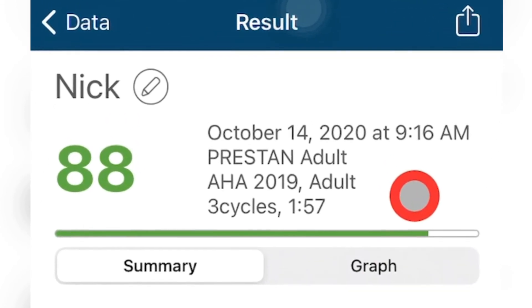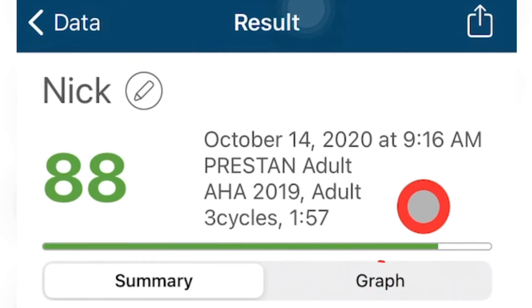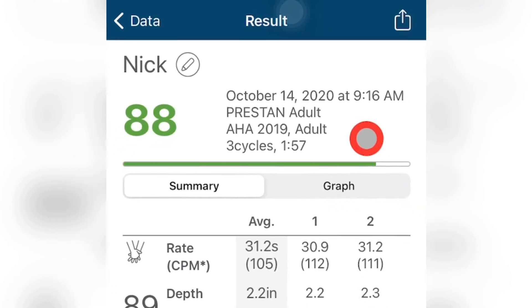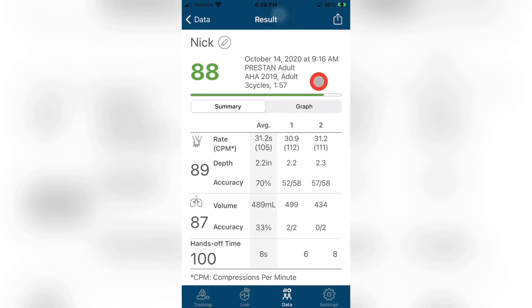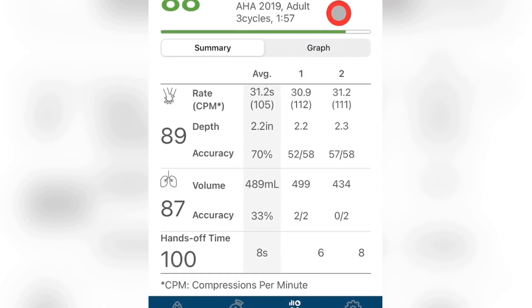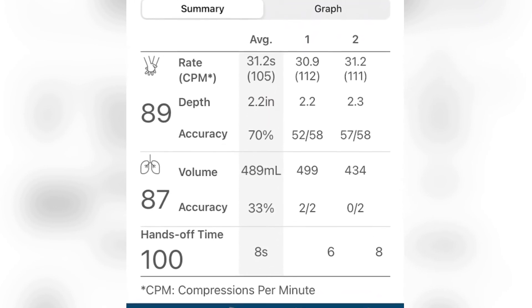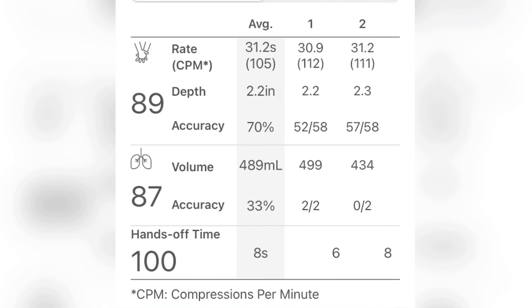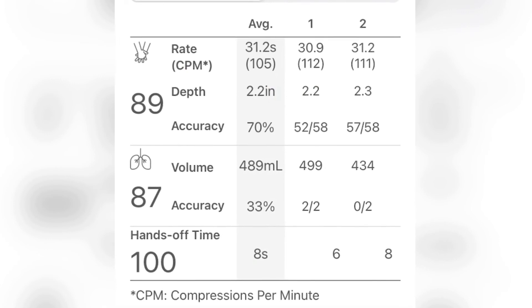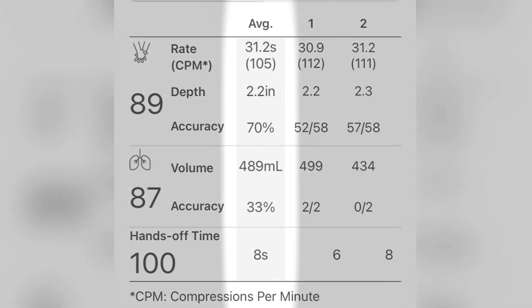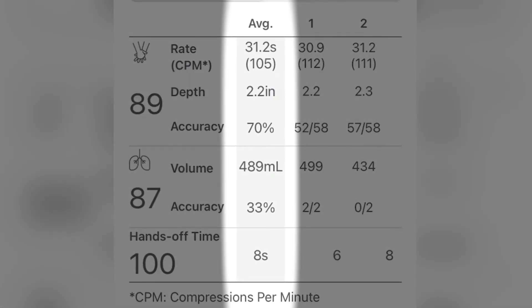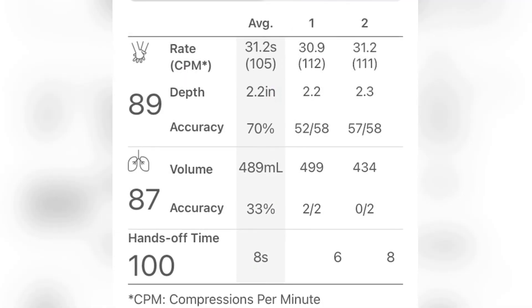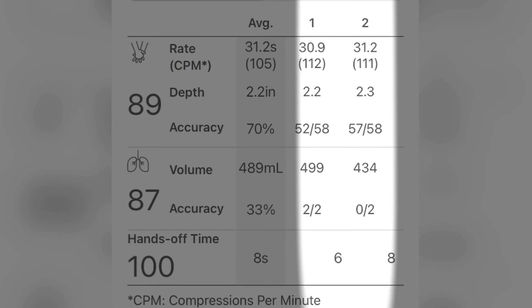Below this, there are two tabs: Summary and Graph. The Summary tab will provide a general synopsis of the training session. This includes data from all the categories collected, including compressions, ventilations, and hands-off time. Down the left-hand side of the screen, you will see each section has a category score. These category scores are combined and are used to calculate the overall training score. Just to the right of the score column is the average column, which shows the averages for all cycles completed within that individual training session. The subsequent columns to the right of the average column show the results for each cycle.